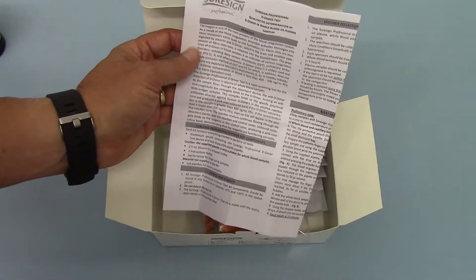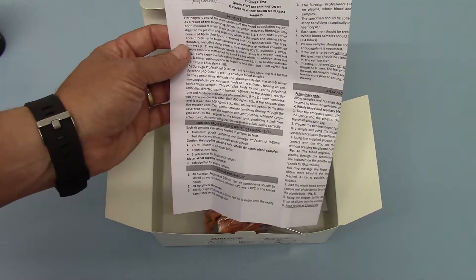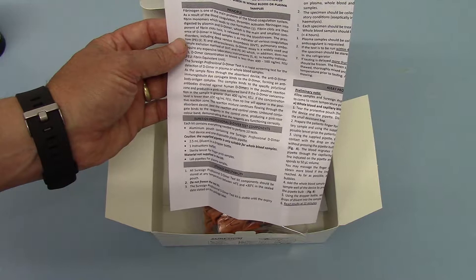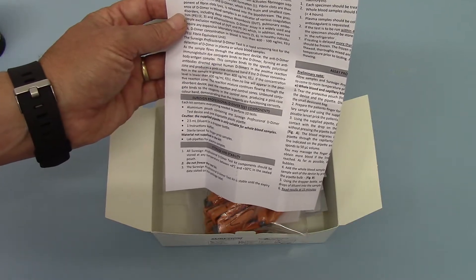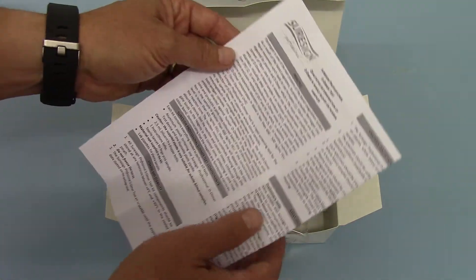This is a D-Dimer test that works to 400 nanograms per ml. At that level it will indicate a positive result; below that level it will indicate a negative result.